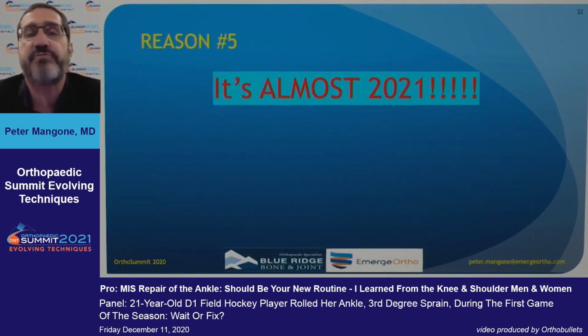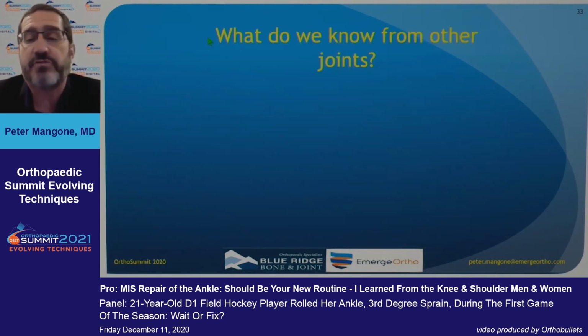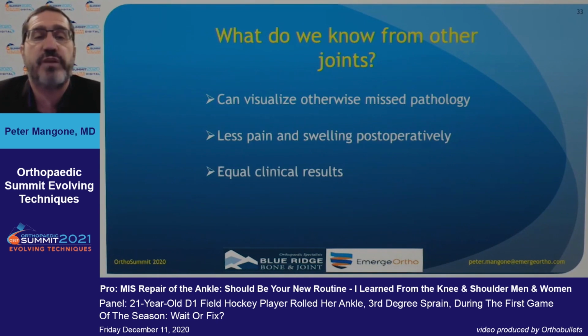And finally, it's almost 2021. We're just a few days away. But every other major joint specialty uses the arthroscope much more effectively than we do in foot and ankle. And so we need to really move into the real world, into what other people are doing. You can miss pathology if you don't look in the joint. There's less pain and swelling in the other joints when they do their surgery this way. They have equal clinical results and higher patient satisfaction.